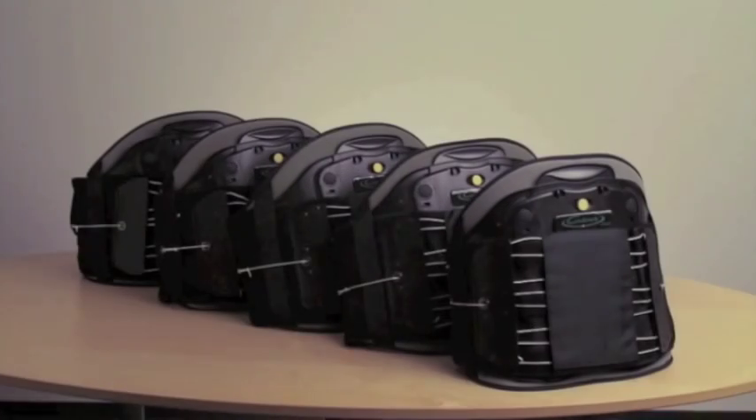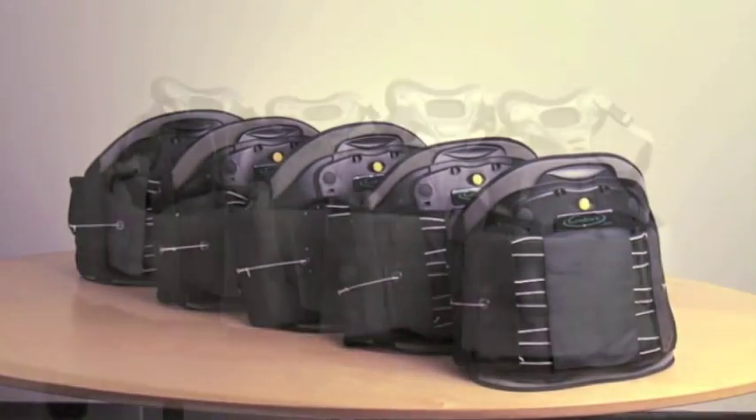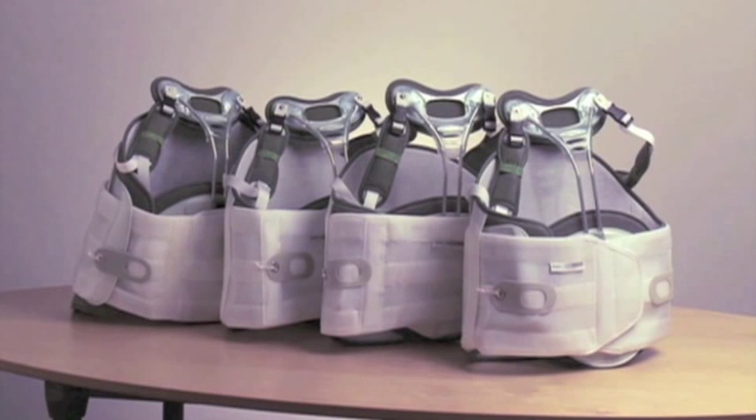For customers who are interested, the Contour LSO and Contour SPK come in pre-assembled sizes.